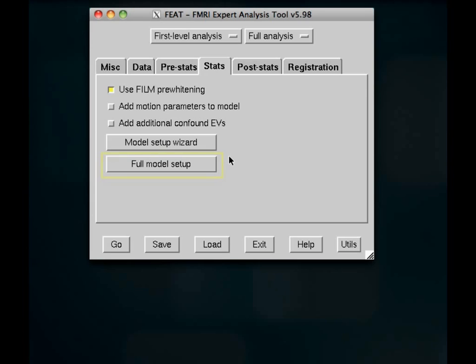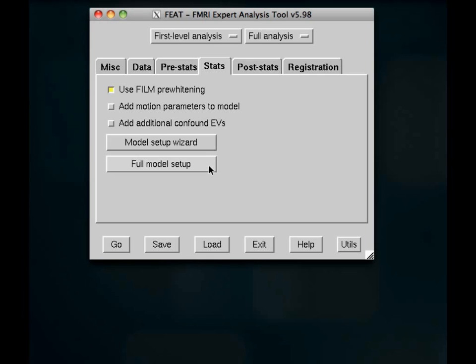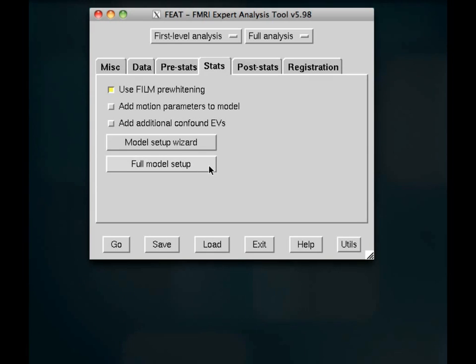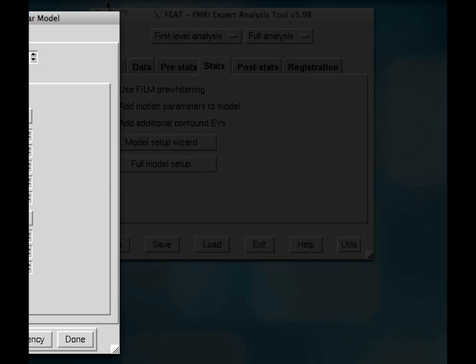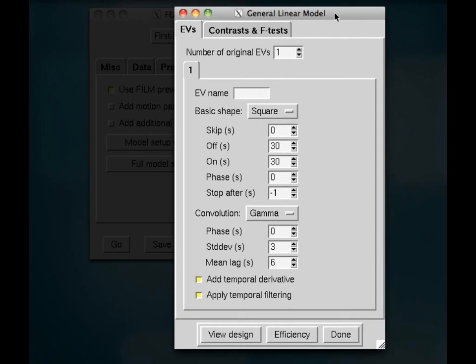So what you're going to be wanting to focus on is the full model setup. The model setup wizard is if you have a very simple block design. Now, for any event-related design, which is more common, you want to use full model setup. So let's go ahead and click on that.